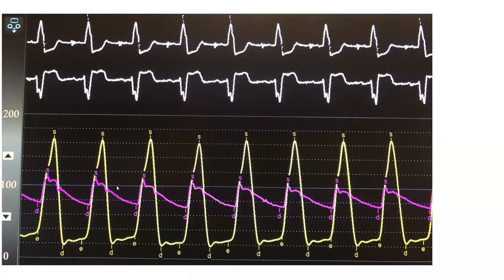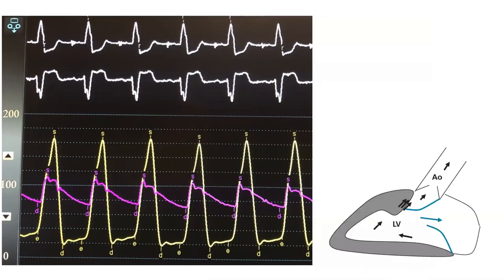The key is that those pressures hug each other, then you get a late gradient and late obstruction — very characteristic of LV-OT obstruction. The more severe the obstruction, the more striking that spike and dome morphology of the aorta will become. Early in systole, the ventricle is very filled and large, so there is less obstruction. As the left ventricle empties, you get a drag on the mitral valve and approximation of the anterior mitral leaflet and the septum, causing worsening obstruction throughout systole — hence that late peaking LV pressure and gradient.